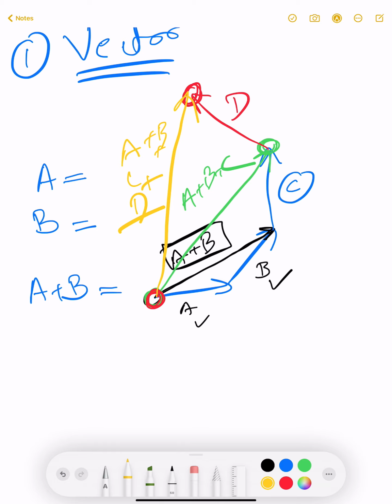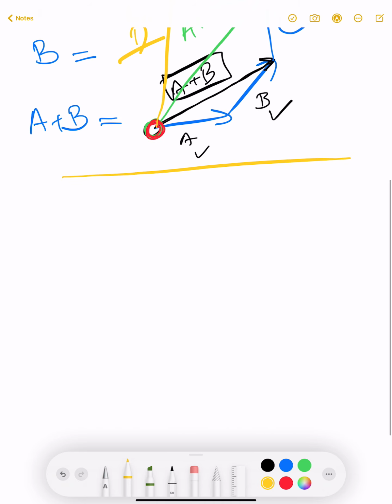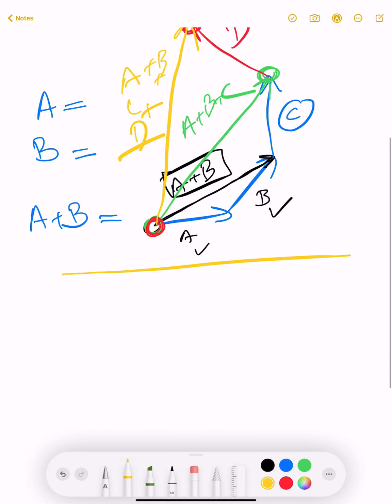We all know this from our school days. Just keep this principle in mind, because to explain the cardiac axis, I need you to know about vectors and how these vectors are added, and ultimately this will lead to the formation of our cardiac axis. And this was concept number one.